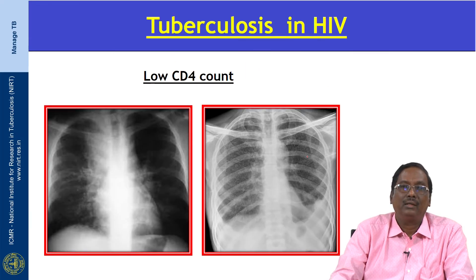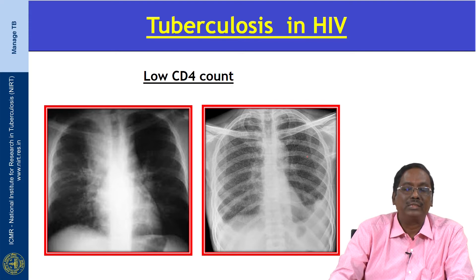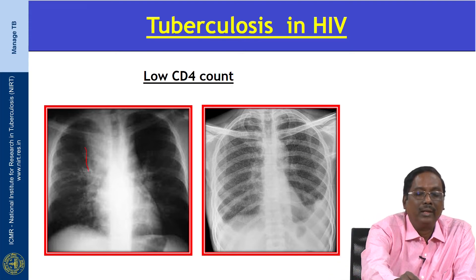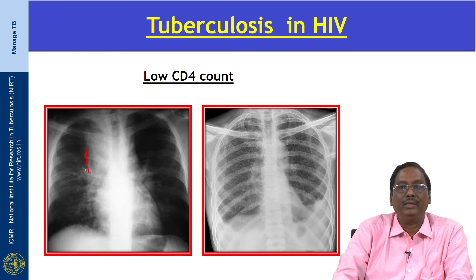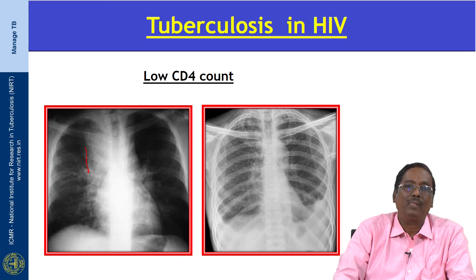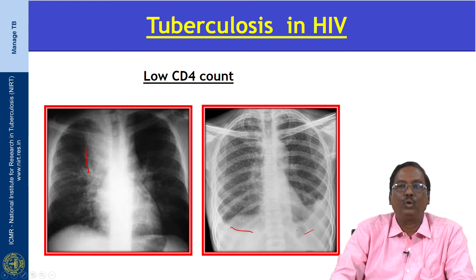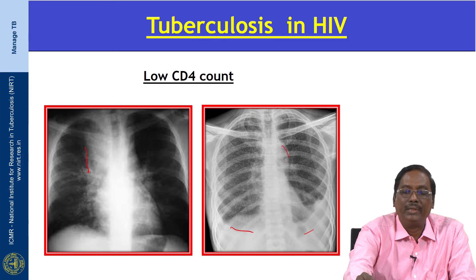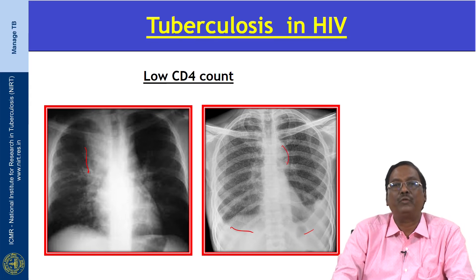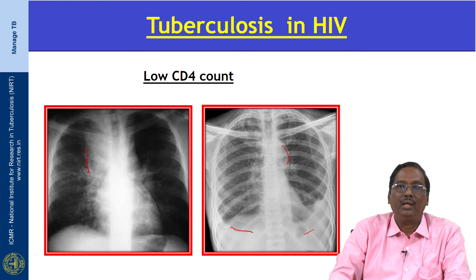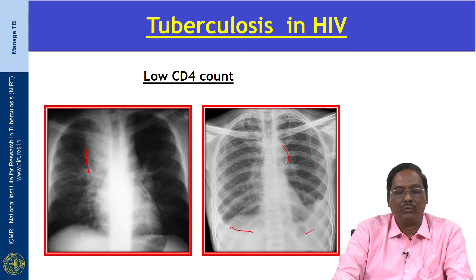Here is tuberculosis in HIV where the CD4 count is very low. This x-ray shows right paratracheal adenopathy, similar to primary tuberculosis. There is bilateral pleural effusion and also adenopathy, typical of the radiological features of HIV-TB in a low CD4 count.